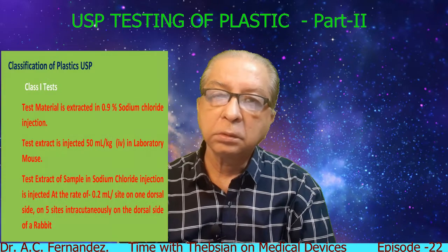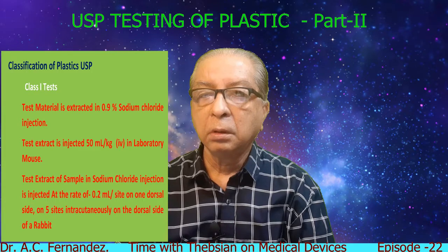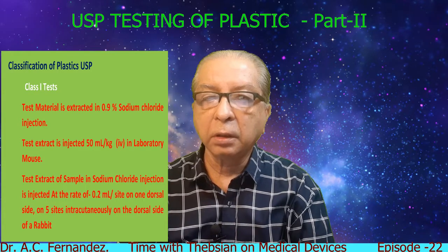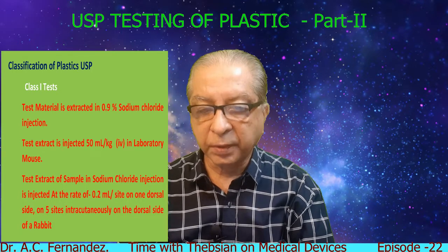Class 1, let us see what tests are to be carried out so that the materials can pass the class 1 test.